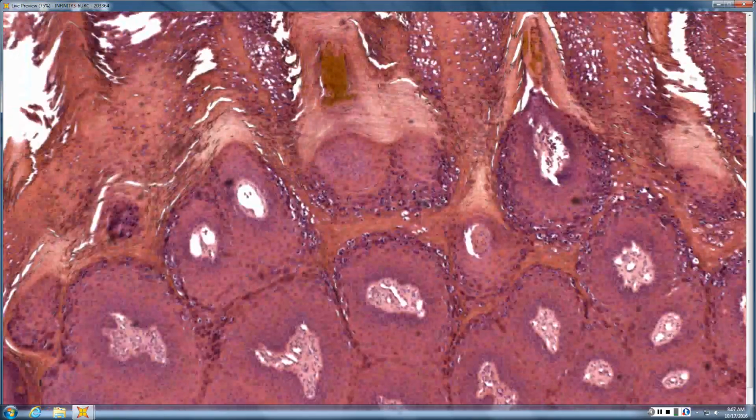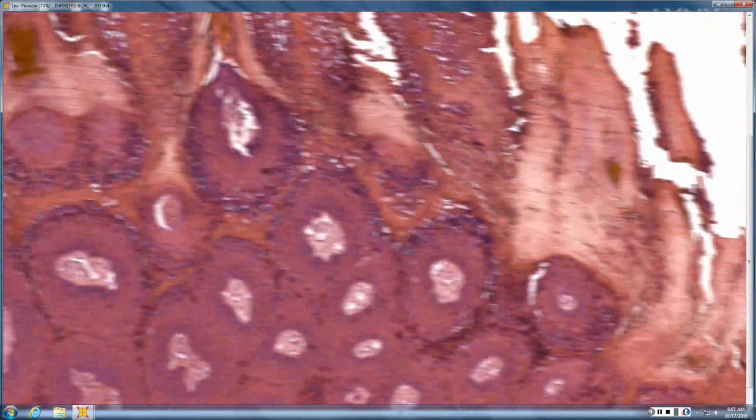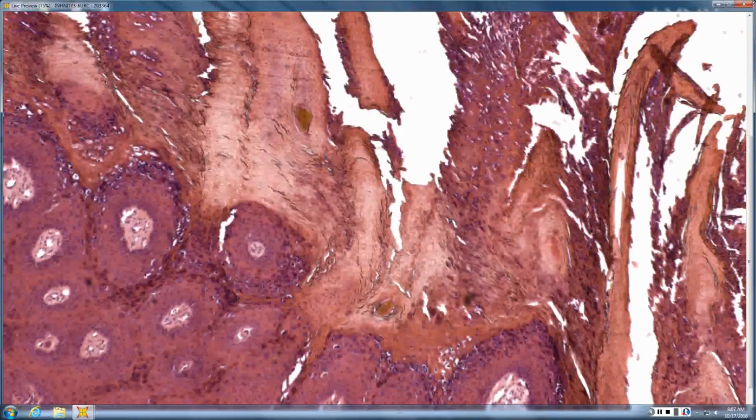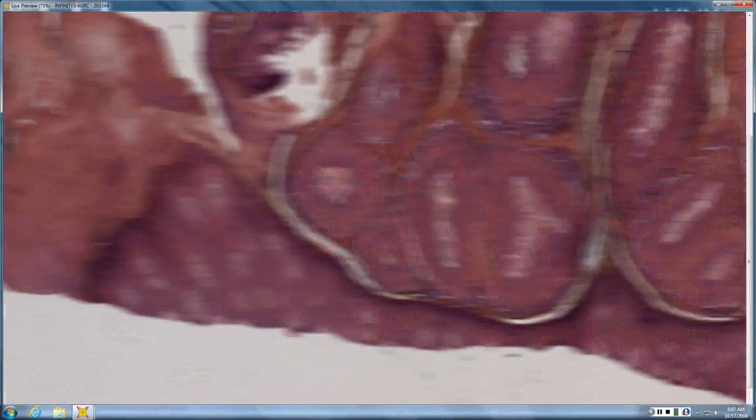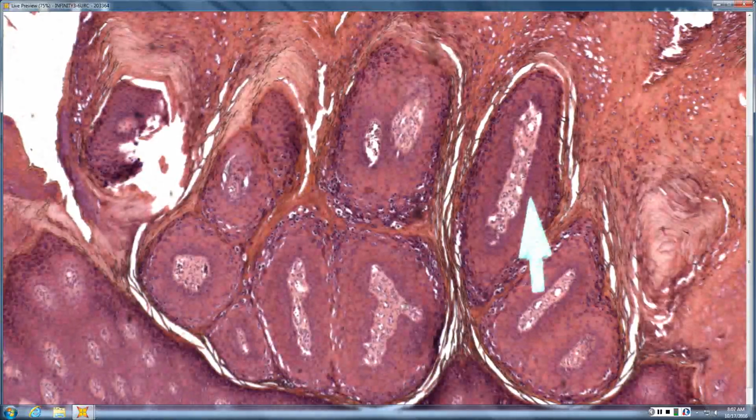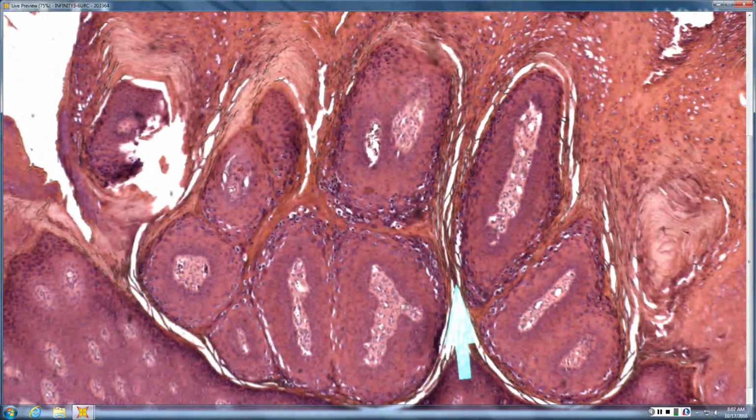So it looks like pink cells hanging off the dermis, so maybe like a poroma. This one's epidermis is more exophytic rather than endophytic. And because we haven't done this chapter yet, let's skip to Brian and then we'll come back. This one looked like it had some viral changes.